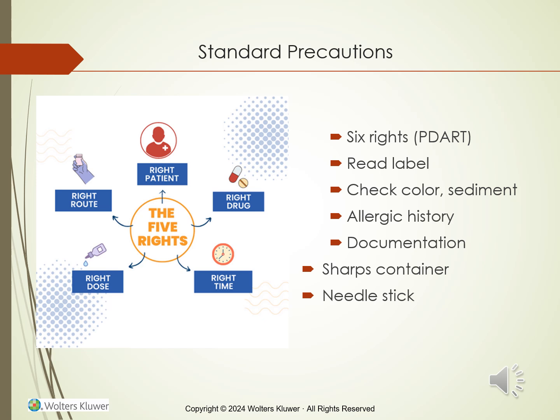You want to throw all needles and syringes away in the appropriate sharps containers. And if you as a worker get injured with a dirty needle stick, it is considered to be a hazardous incident and must be reported as a critical incident. So appropriate measures are taken for documenting it as well as for safety for the employee or the worker.